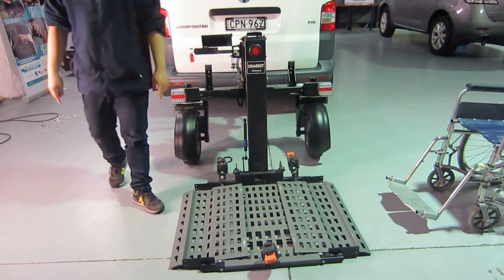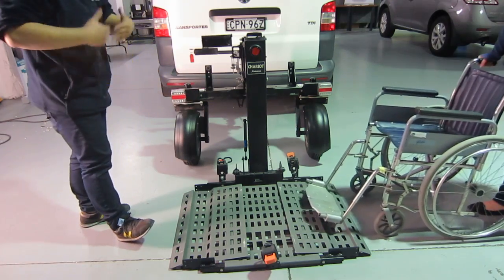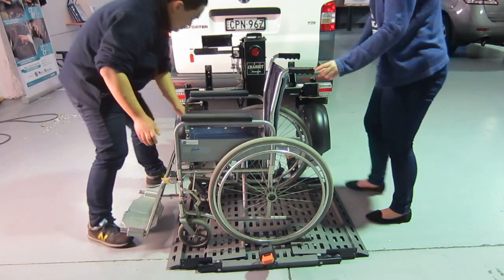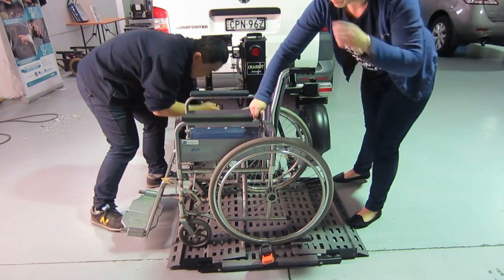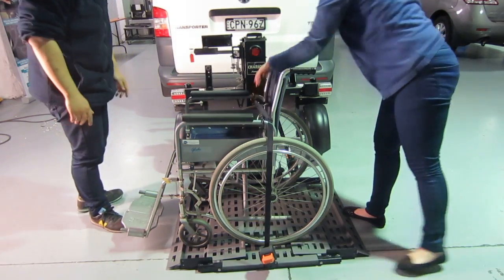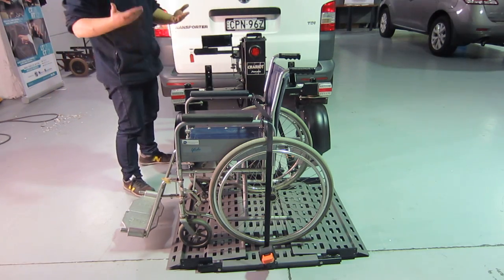The next step is to steer the wheelchair onto the platform and secure the wheelchair. The last step is to raise the platform again.